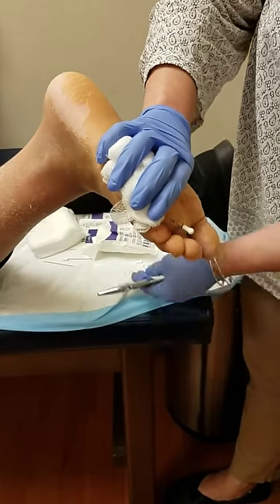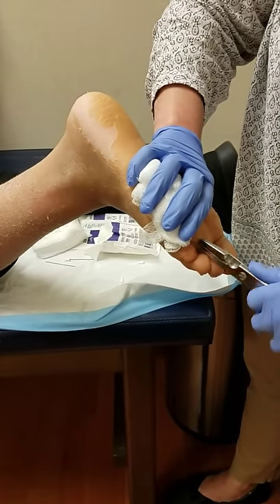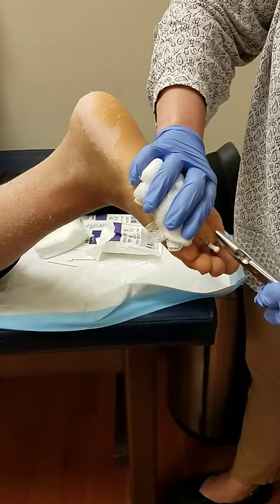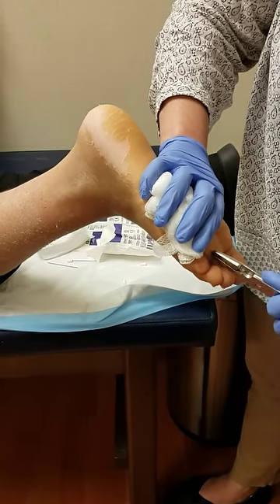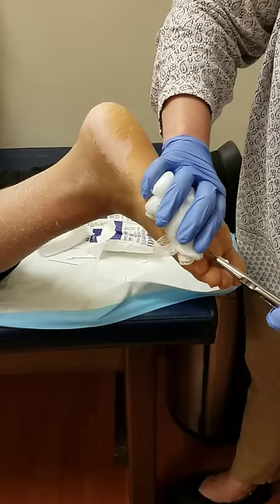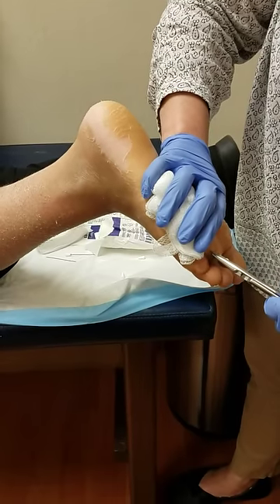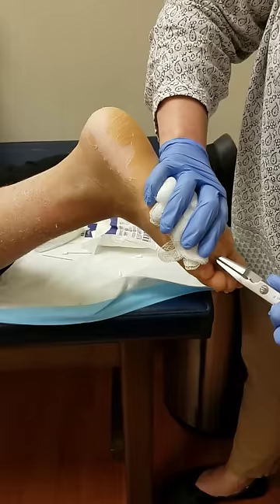If you want, I'll slap you on the side of the head. If you didn't feel that one, you won't even feel your foot. It's okay — the thing slipped off the pin. It's all good. You want a pain pill, you can get one. I told you that. Too late now. I tried to tell her that earlier.